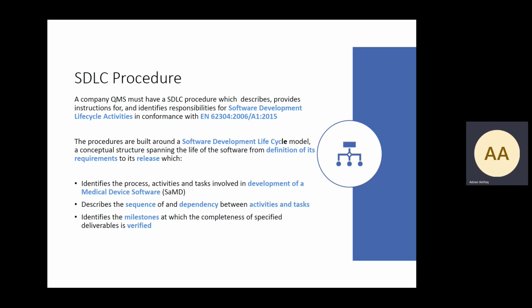These procedures are built around the software development lifecycle model, a conceptual structure spanning the life of the software from definition of its requirements to its release, which firstly identifies the processes, the activities, and the tasks involved in the development of the medical device software. It describes the sequence of and the dependency between activities and tasks. It identifies the milestones at which completeness of specified deliverables is verified.